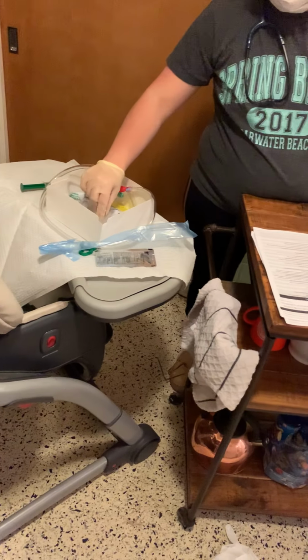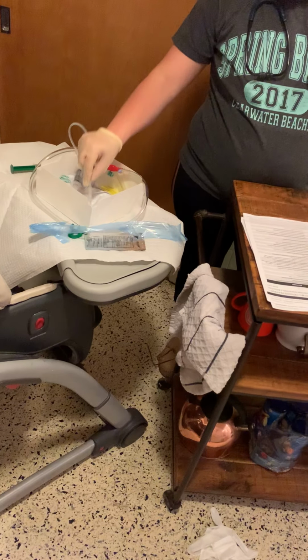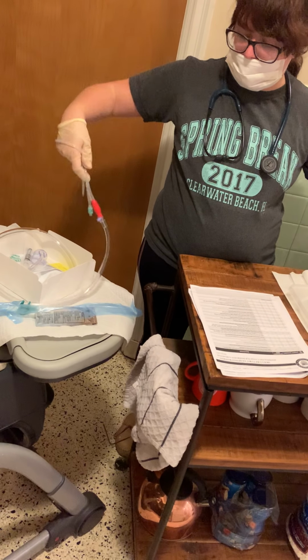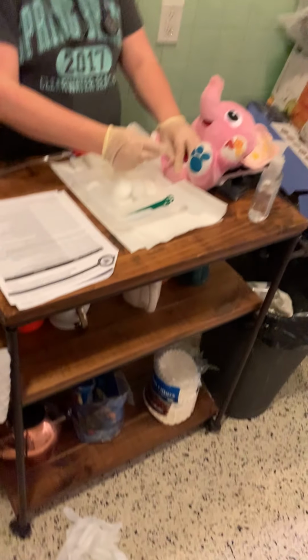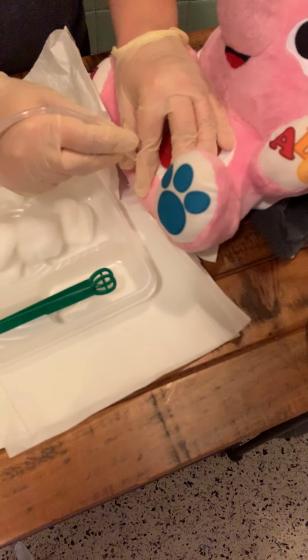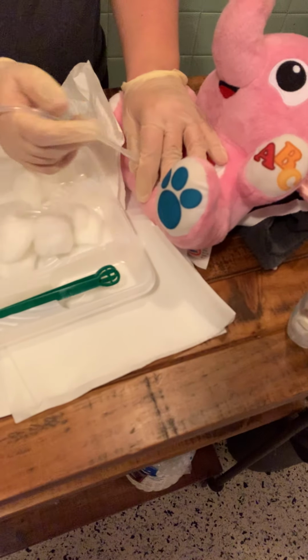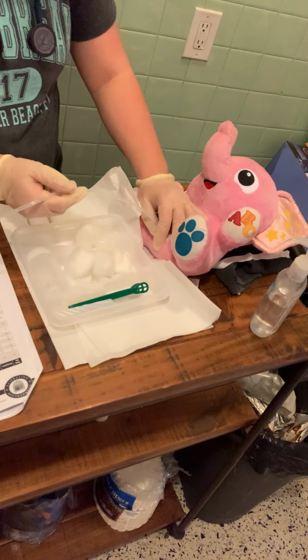lubricate, make sure my tip is lubricated and sterile. I'm going to have had it wound around my hand, and then I would insert it into the urethra, and I would insert it in until I saw urine, and then in a female I would insert it 1 to 2 more inches into the bladder.